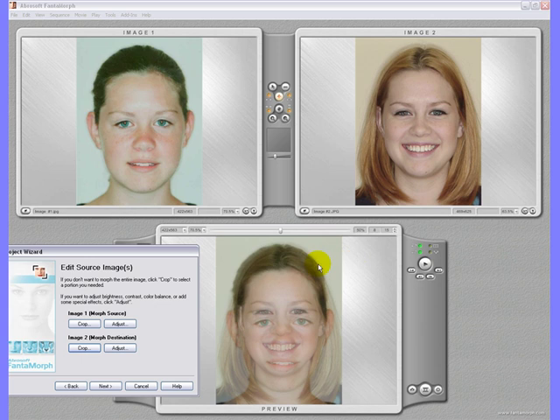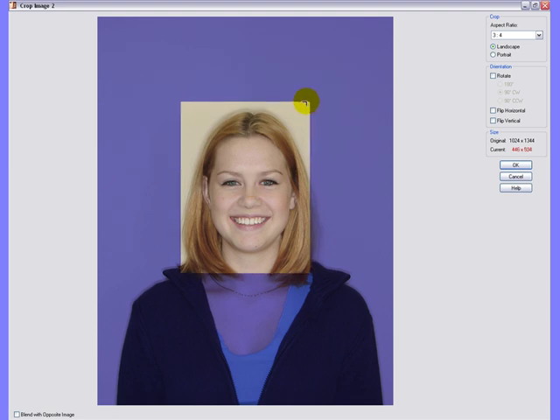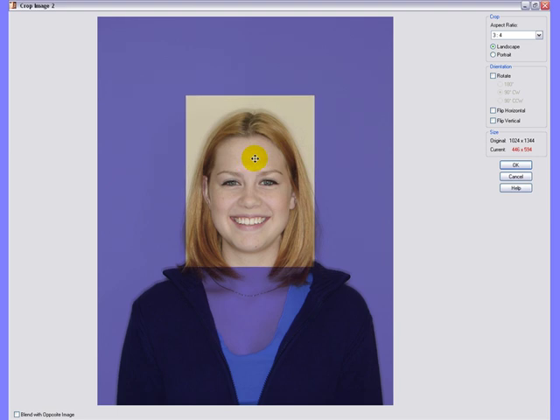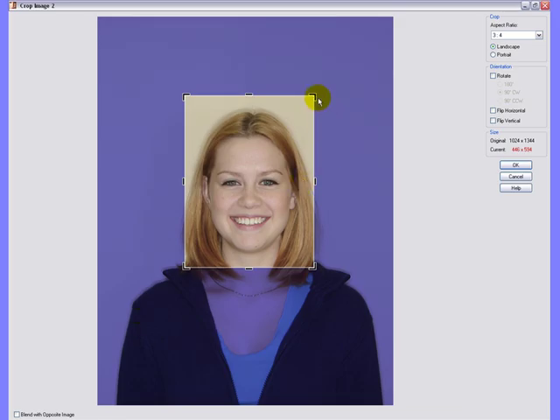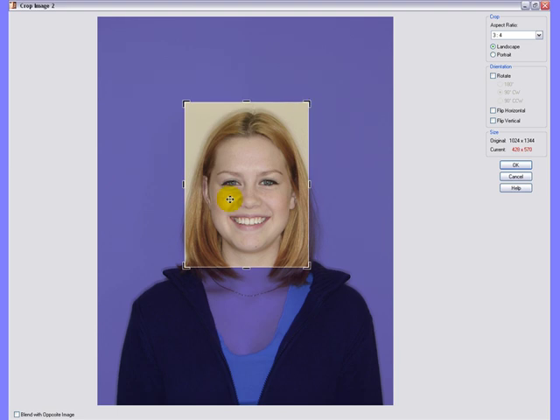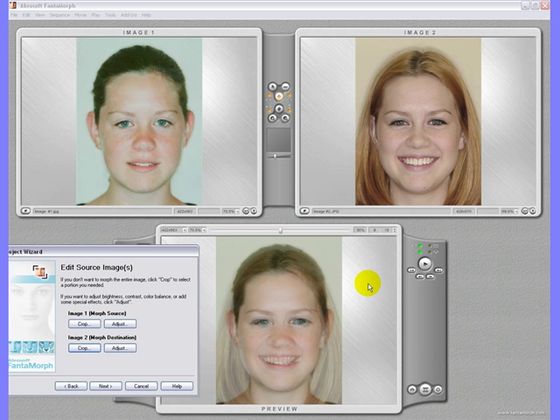Now we can see on the overlay window that the images are not exactly on top of each other. We are going to adjust it. This is done by trial and error. This is better, but I think we need to do one more adjustment. This is what we are looking for. Click on next.